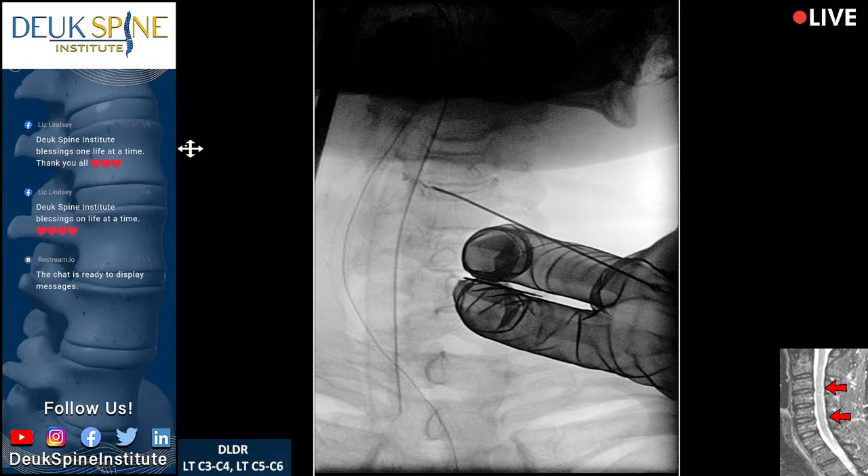Look at the tear up there at C3-4 on the patient's right — we go opposite the worst herniation. From the tip of the needle out, you can see the tear. And there's dye right there in the foramen, right around the nerve root.